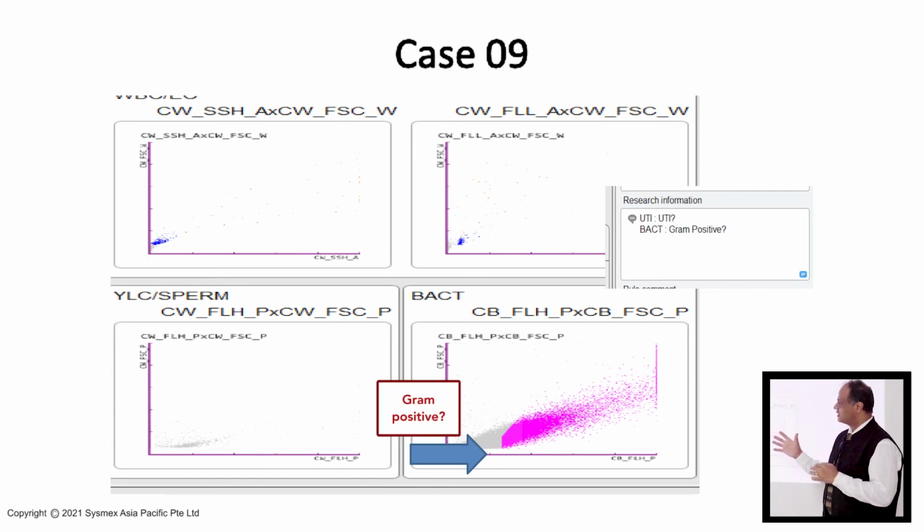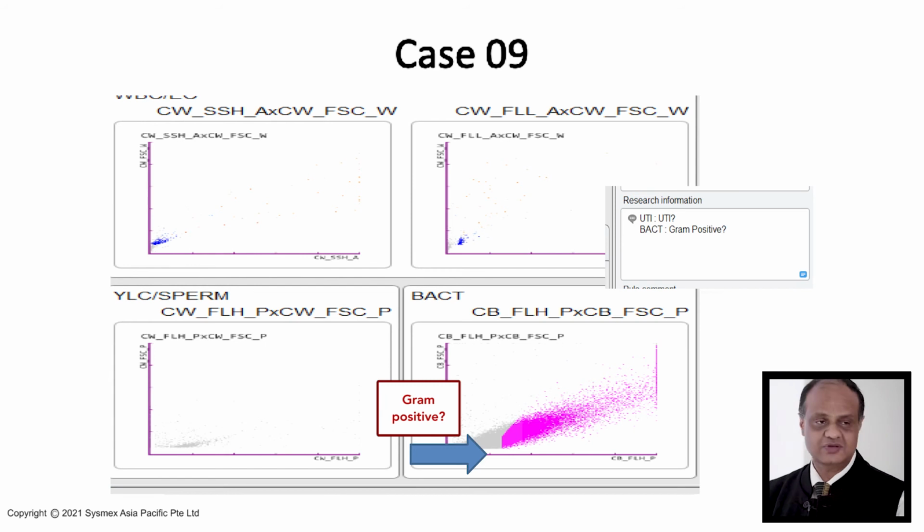See, one of the uniqueness about the Sysmex urine analysis machine is that it is able to give us information about whether it is a gram-positive or a gram-negative microorganism in the given urinary tract infection, which helps us to make sure which urines can go in for the cultures, so that we will be having a good harvest of information.